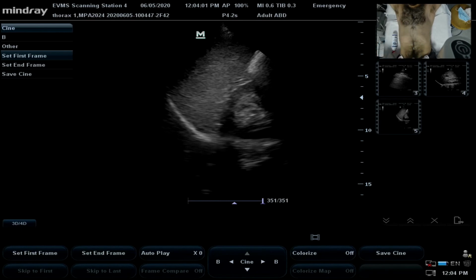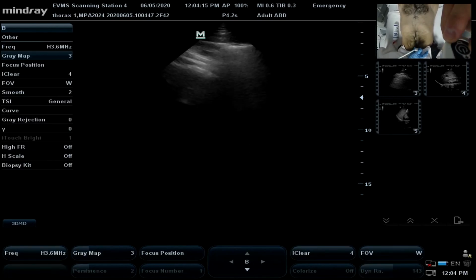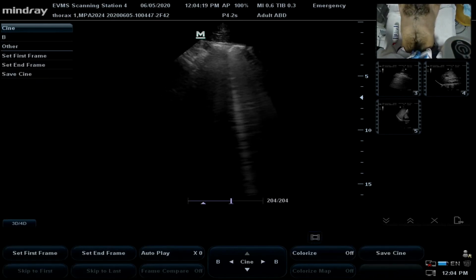I'm going to have notch towards the head, and I'm going to angle quite inferior. And I have a clinical, so here's my sagittal bladder done, but look, there's no bladder visualized. He just went to the restroom, bad patient.